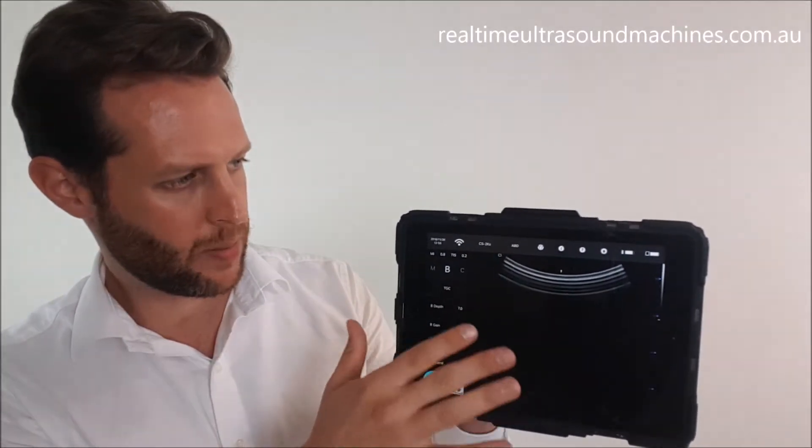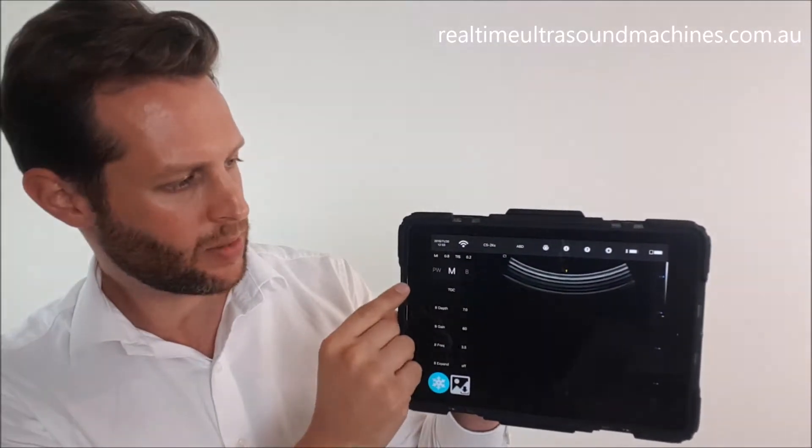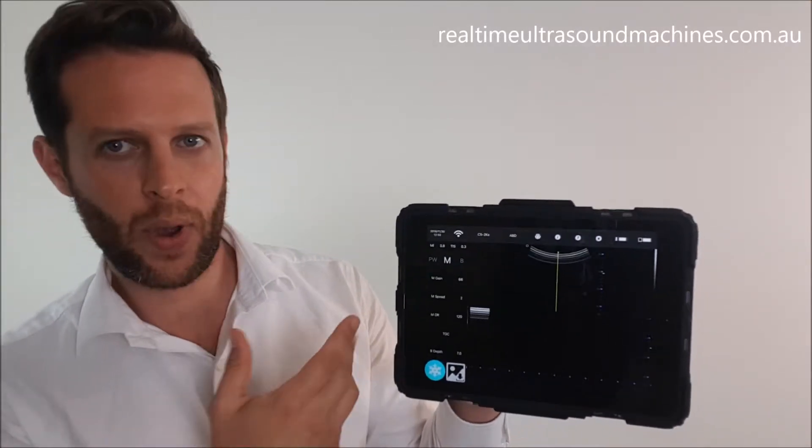On the black-and-white version, you've got two different modes to choose from: normal B-mode, which is what we're in at the moment, and M-mode. You can get to M-mode by sliding those mode keys at the top of the screen left or right. Wait a second or two and it will switch to that next mode you've selected.